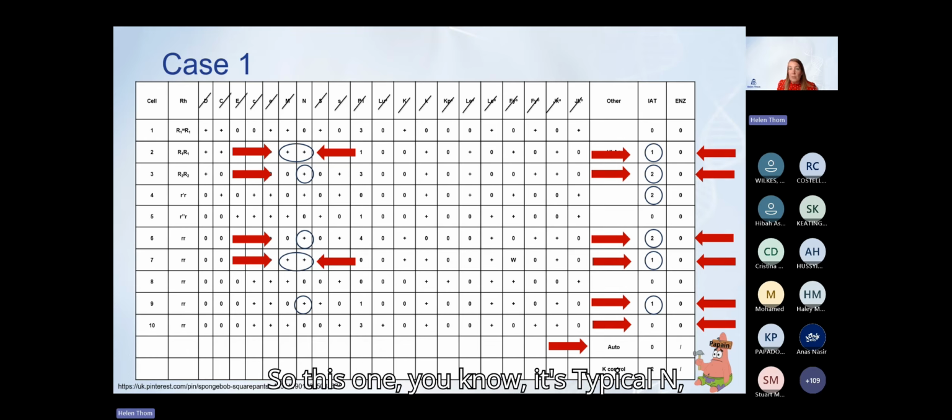This one is typical anti-N, that classic showing dosage, but it's also destroyed by papain, and that comes to understanding how antibodies behave, and the impact of papain as well. So papain has shown us that that's another way to confirm that it's there. In this case as well, we actually have 2 positives and 2 negatives on that as well.